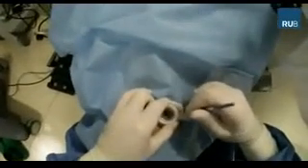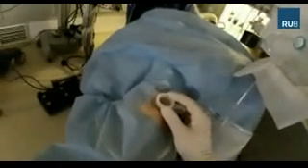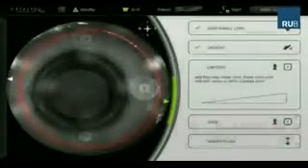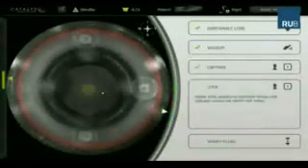After the successful redocking, which is usually easy in pediatric eyes, the interface again is filled with BSS. The catalyst system controls the lateral forces as well as the vertical forces during docking.